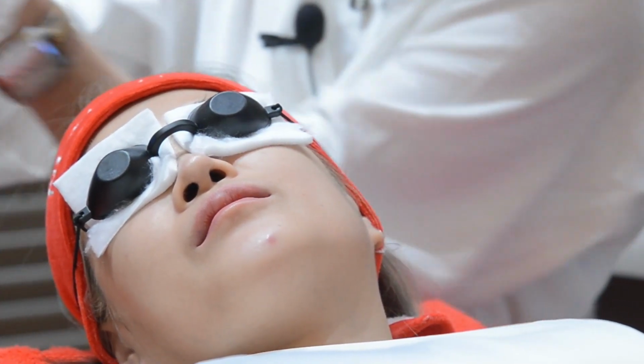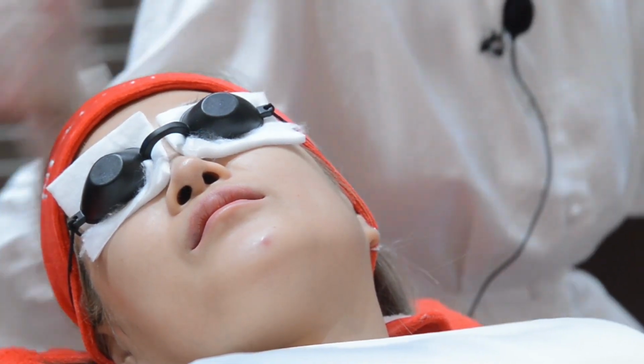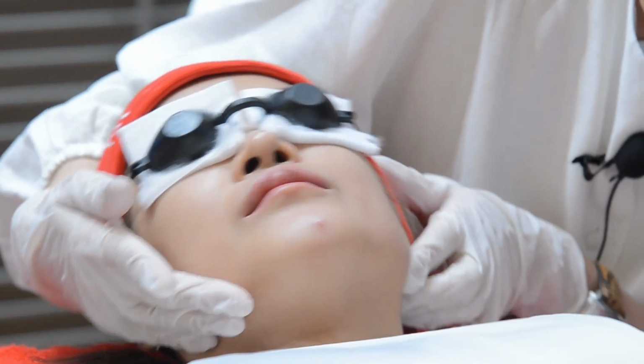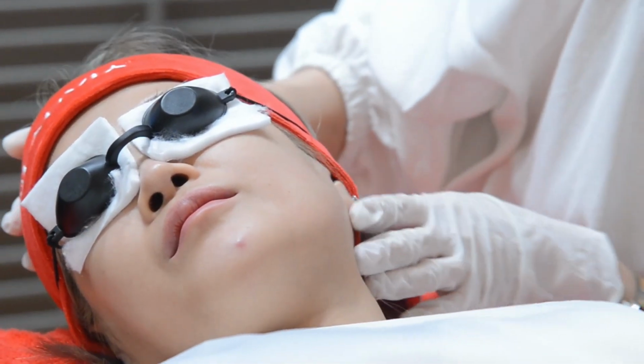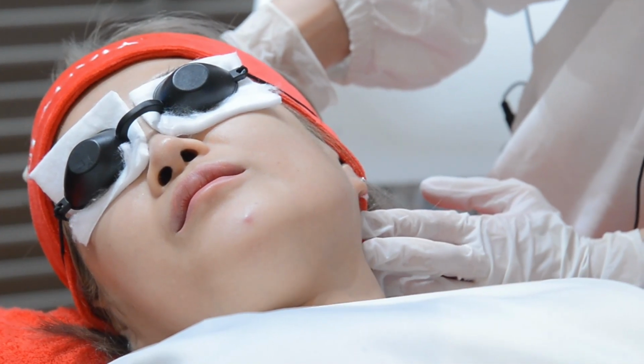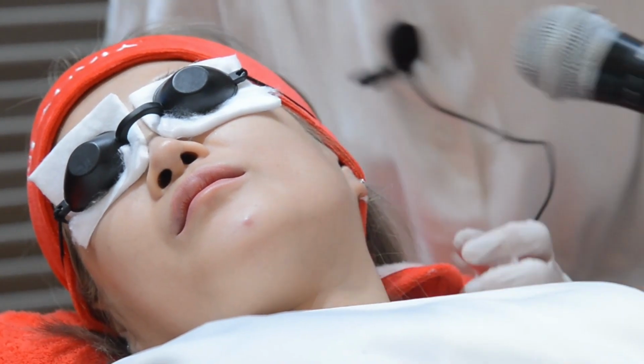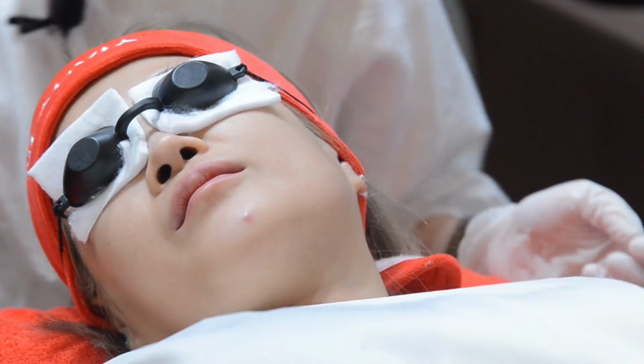Okay, so let's wait a little while to see the effect after the treatment. Right now, we don't see maybe a little bit of slight redness. And you will see the dots more obvious in a short while more. So while waiting, let's talk about the other mode.